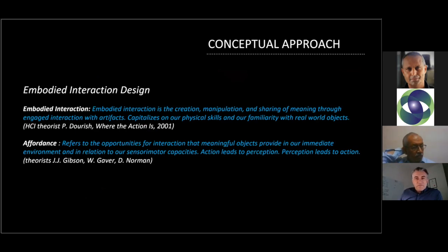Our team took a research approach that spans design, arts and science domains to tackle the complexity of designing for brain injury. We explored a range of guiding philosophies to help direct the design and the research. To design the iterations of our system, we utilized concepts from embodied interaction design, a theory developed by human-computer interaction designer Paul Dourish. Embodied interaction provides a design framework that focuses on first-person lived body experience and its relationship to the environment.